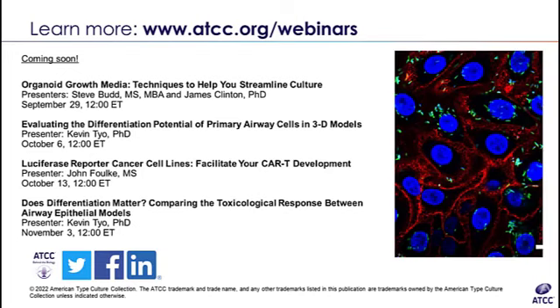So for STR, if for publication purposes, I assume you're going to want to send in cells that are representative of what you used in the publication. So I assume probably the most recent passage. I'm not sure if there's a limit per se for that. As long as it's a human cell line, it should still be able to be picked up for STR purposes. Mycoplasma, I don't know if there's necessarily a passage recommendation for that. It can be tested for repeatedly, I assume, but I'm not sure if you would have anything to add on to that, Steve.